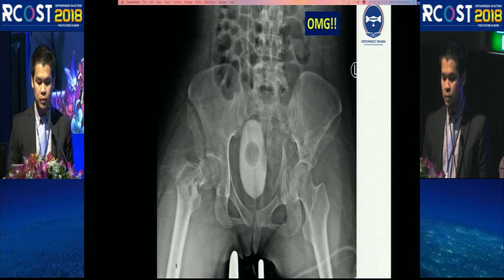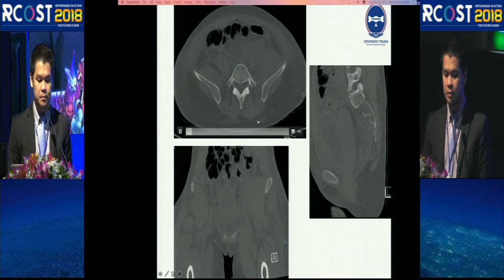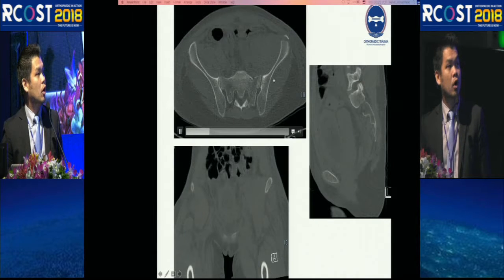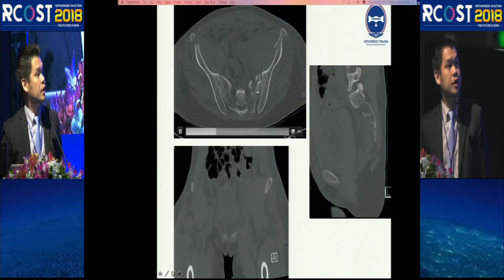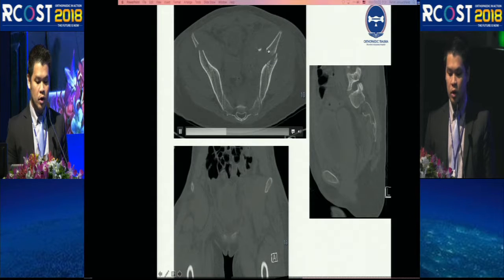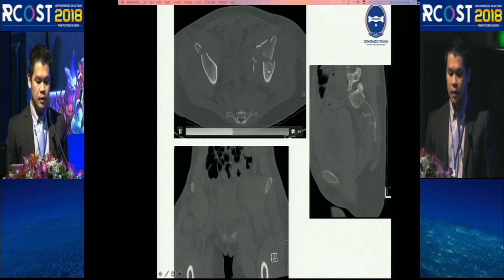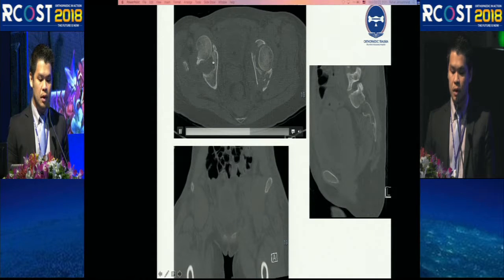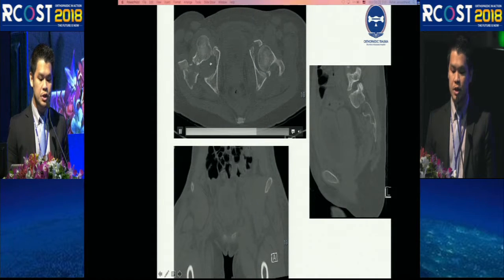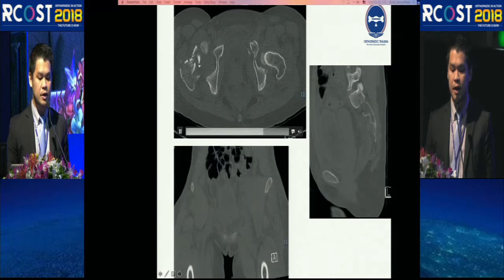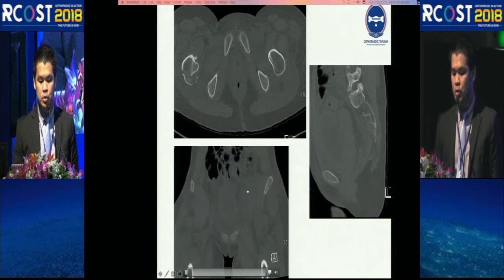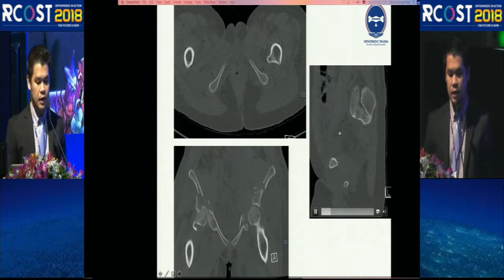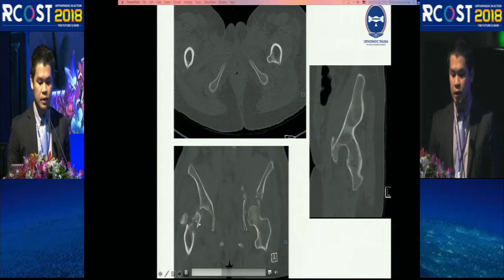I'll show you the axial CT scan. Simply, the left side is a both-column fracture. You have first the sacral fracture in the back, this is the anterior column, and the posterior column with some posterior wall. The right side is anterior dislocation of the femoral head and a neck fracture.